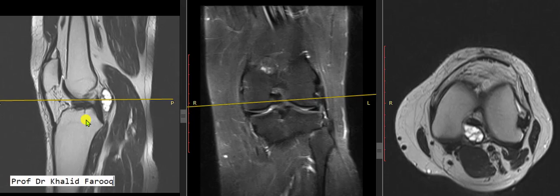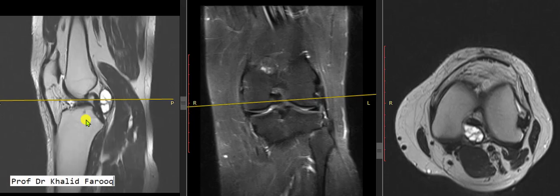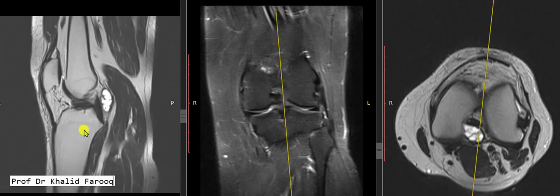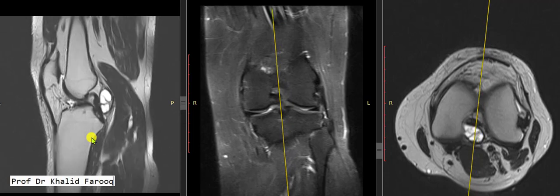We can see there is anterior translation of the tibia, and there is mild buckling of the upper end of the posterior cruciate ligament. Here we could not see the anterior cruciate ligament, so this represents a total chronic ACL transection.